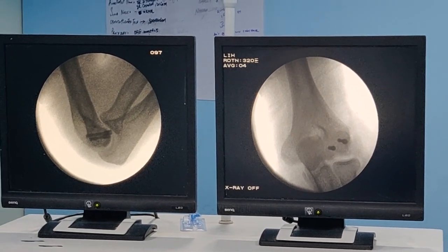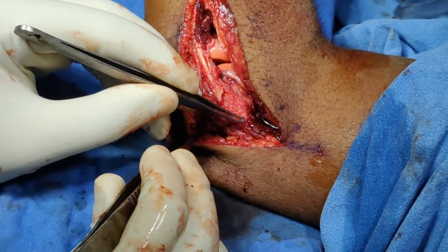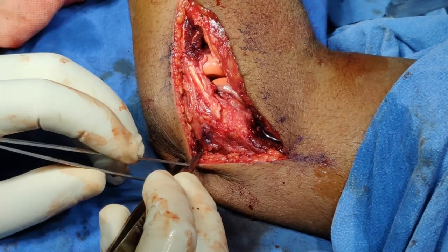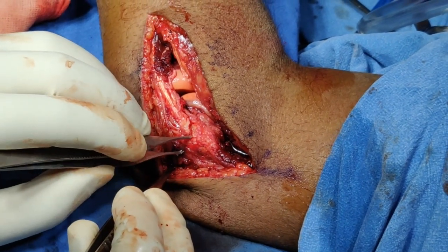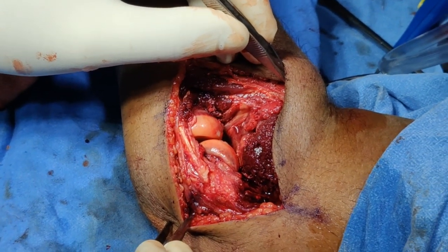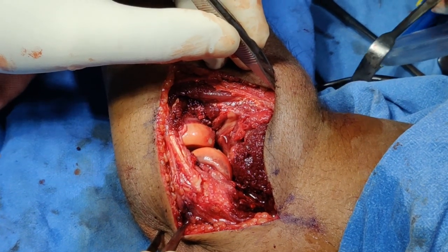One important tip I want to mention: when dissecting around the lateral epicondyle, keep your dissection in the anterior half. Do not go posteriorly — this risks damaging the lateral ulnar collateral ligament, which can cause instability in the future. Stay in the anterior half and leave those posterior structures alone. Next, give the wound a thorough wash with saline to remove all debris from the trauma and from screw insertion before closure.